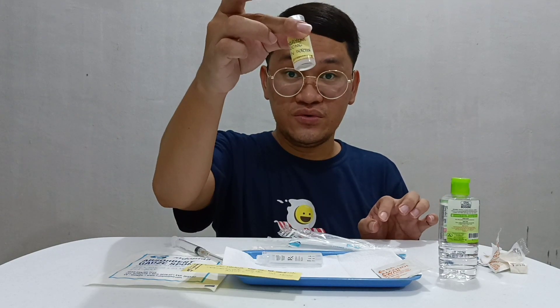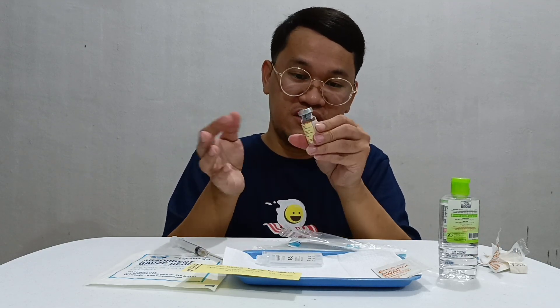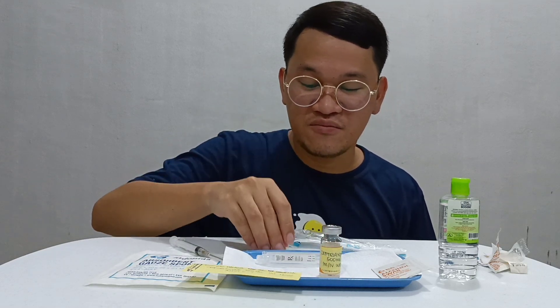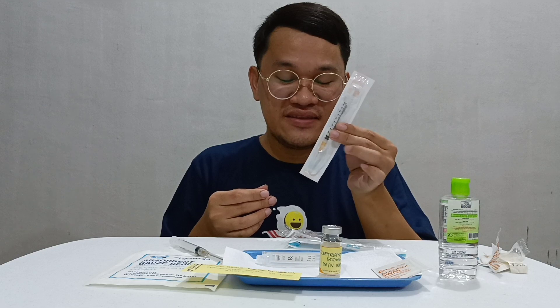Now I need to dilute the medicine. Using a rolling motion on our palm — do not shake, just roll it on your palm. Now that I have diluted this one already, I can proceed to the preparation of my skin testing.